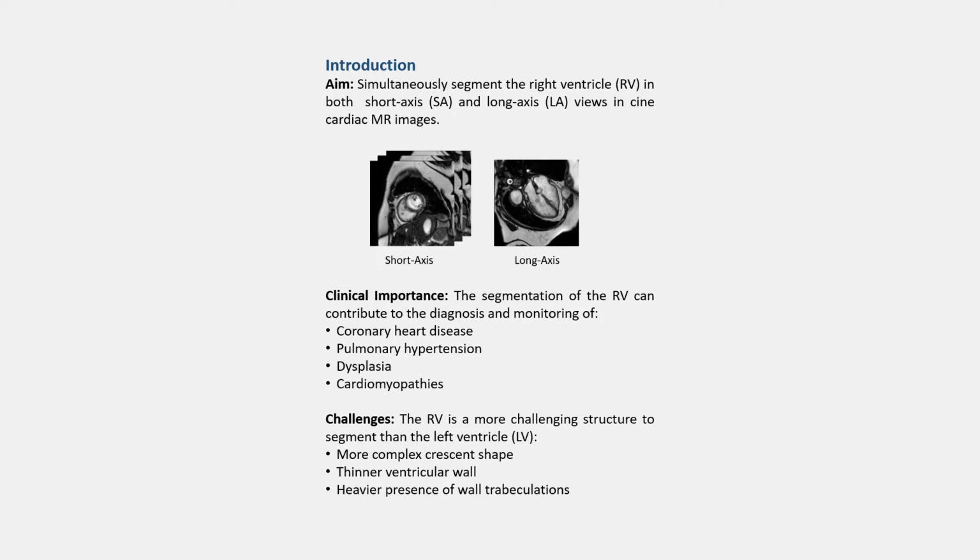This is due to the fact that the short axis slices are thick, making these boundaries difficult to identify. Hence, a slice along the through plane of the short axis, the long axis image, can help us localize better the ventricle. As we can see from the two images, the short axis is a stack of 2D images creating a 3D representation of the heart. On the other hand, the long axis is a single 2D image that captures the 4-chamber features of the heart.